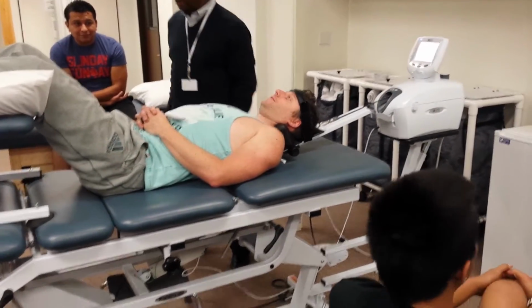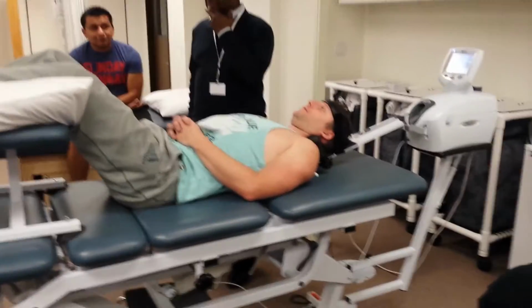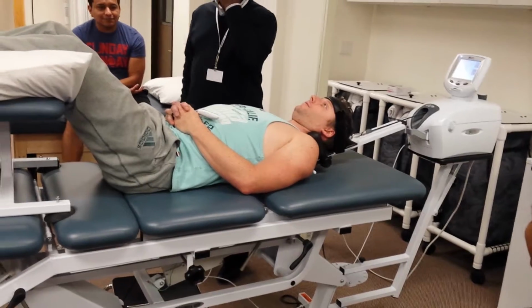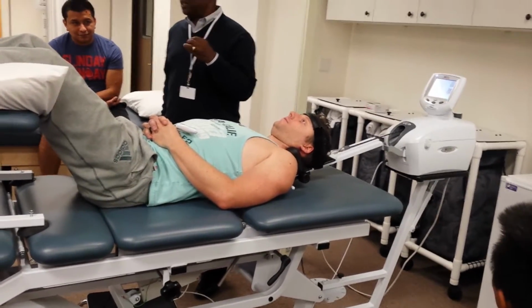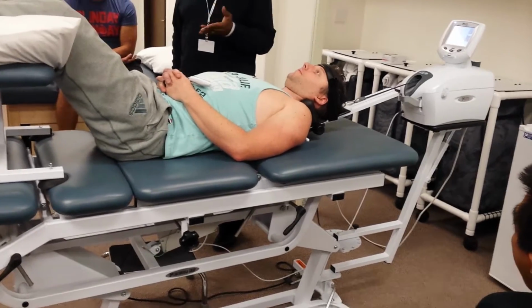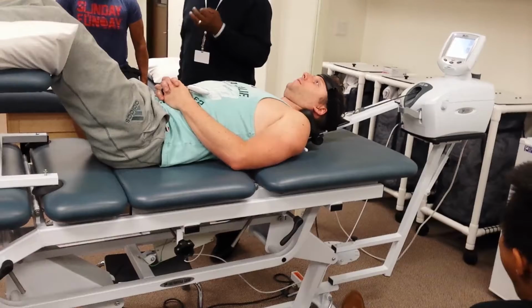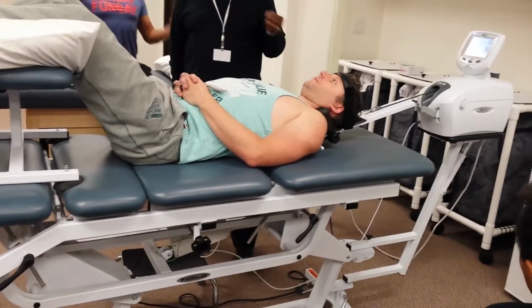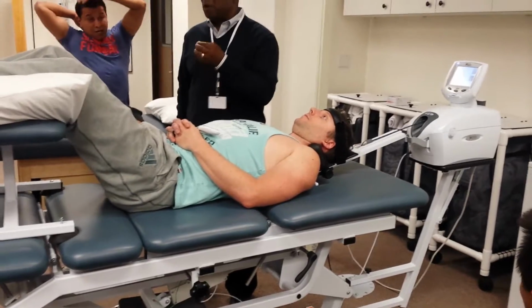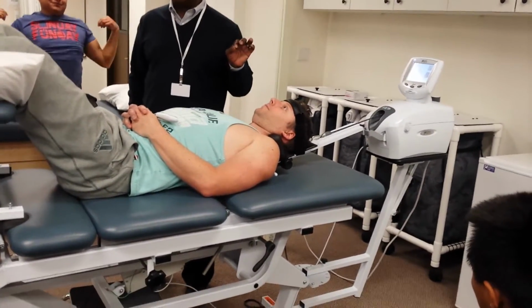So, check it out. Has anybody ever had traction on them? No? Awesome. You have it on your back? Yeah. Most of the time the clinics don't use it, not even a little bit. If you guys want to look into this, study your stuff, study your notes, study your book, because this can be a really, really powerful tool. And if you become good at it, believe me, most therapists are shy of it. Most PTs don't like to mess around with this too much.